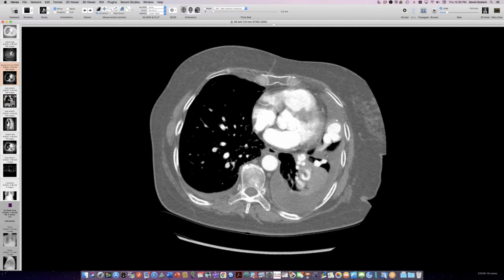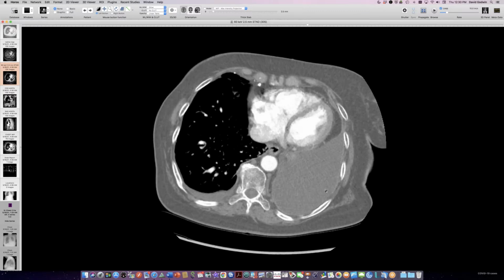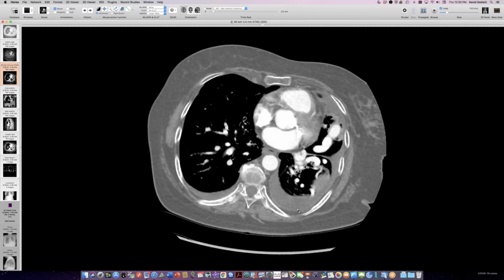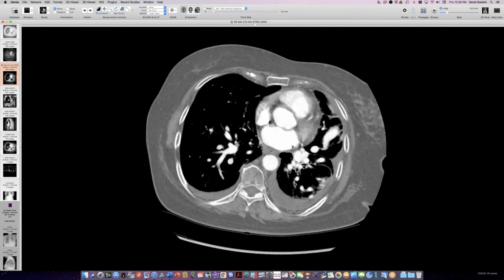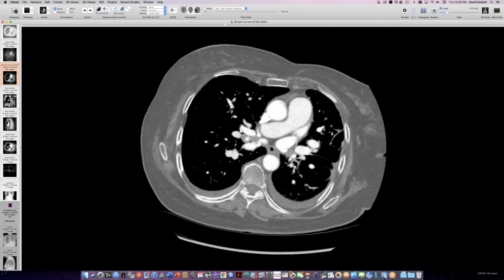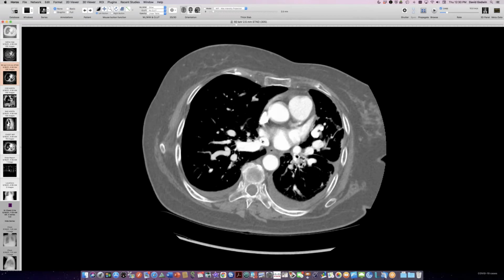So this plays into a very nice physiology here. If you have high pressure in veins, that's when you get pleural effusions. Normally with heart failure, pleural effusions are larger on the right than the left. Hers are larger on the left than the right, and it reflects the differential disease that she has obstructing her pulmonary veins with these varices that have developed there. And I think that also contributes to her right pulmonary vein being pretty large here, because there's a lot more blood flow occurring on the right than the left because of this obstruction over here.